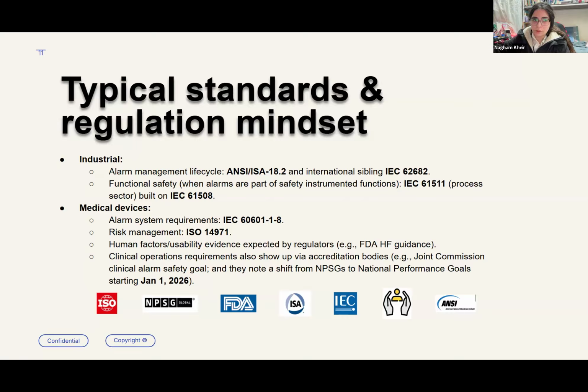So in the IEC 60601-1-8, it explains that the audible and the visual alarms should be in a certain way. For example, I think as I read through it, it's mandatory to use colors in the alarms, and this is an example I'm going to bluntly give here.